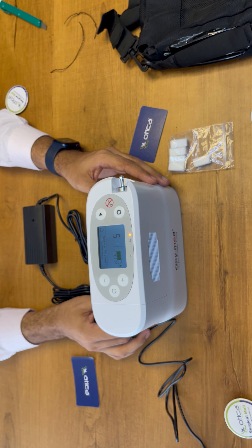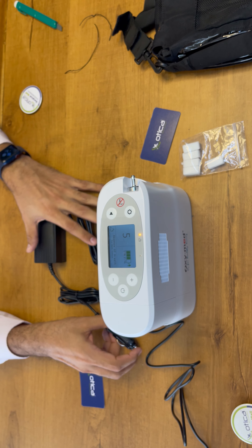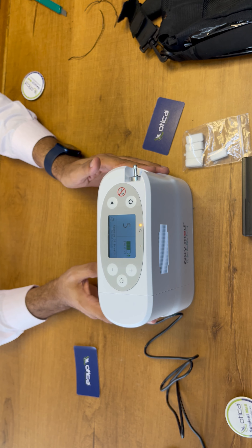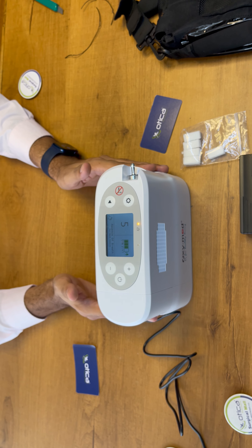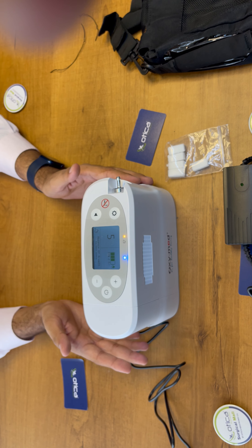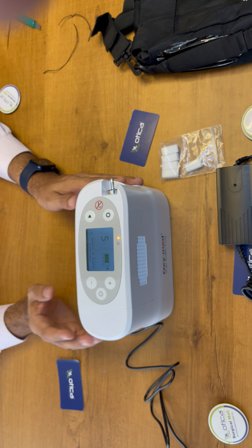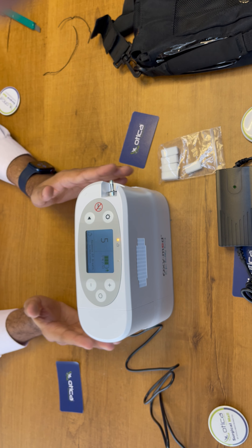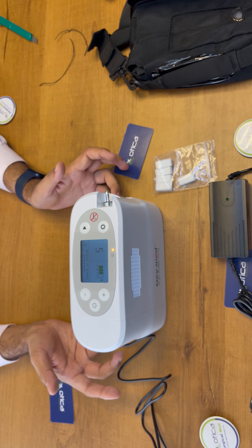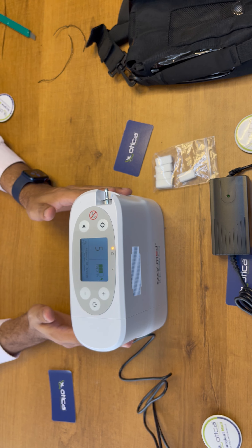Our suggestion: whenever you have power available, connect it and use the device on power. When there is no power and you are walking or traveling, use the device on battery. But make sure this device is not for continuous 24/7 use — it is made for travel purposes, walking, jogging, and outings. If you are using oxygen 24 hours continuously, this device is not recommended; you should use a stationary machine. Thank you and goodbye.